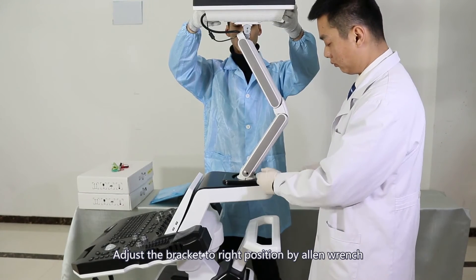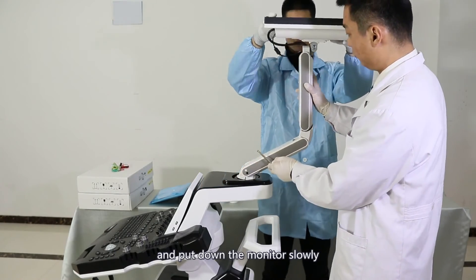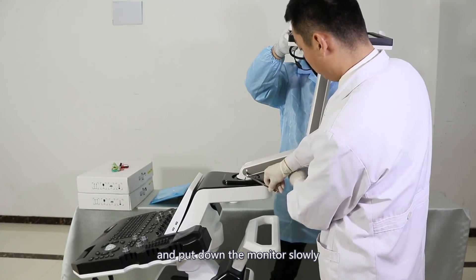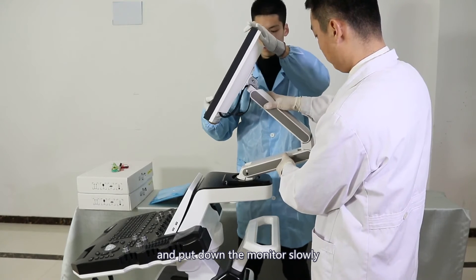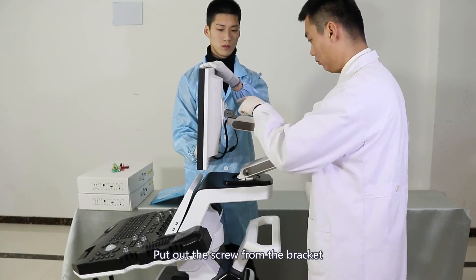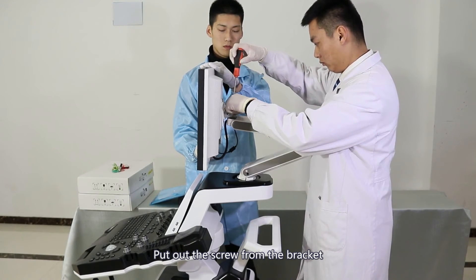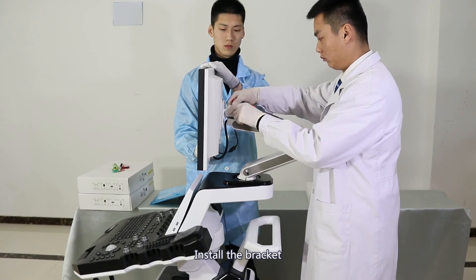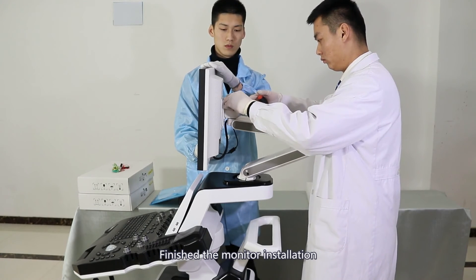Adjust the bracket to the right position using the allen wrench and put down the monitor slowly. Remove the screw from the bracket, install the bracket, and finish the monitor installation.